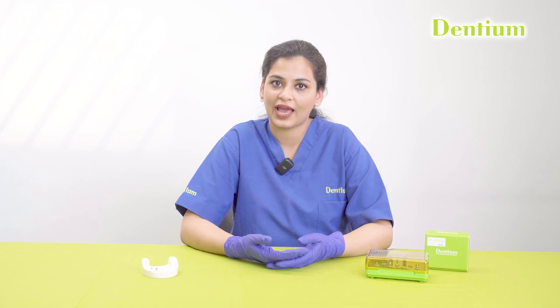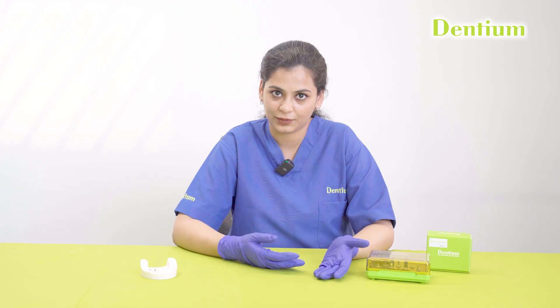Multi-unit abutments have many advantages over other abutment options. The main indications for multi-unit abutments are: it can be used in all full arch prosthetics, when correction of implant angles is required, and when the patient's implants are placed at different positions and different depths. When there is a depth disparity, it is a preferred treatment option.